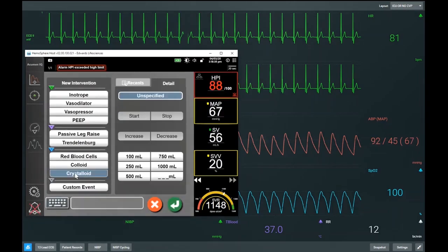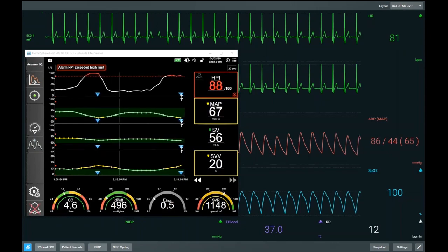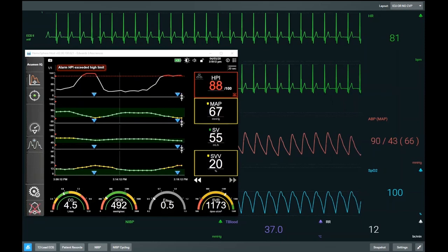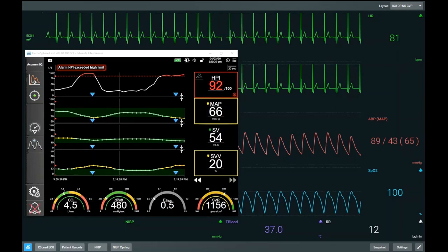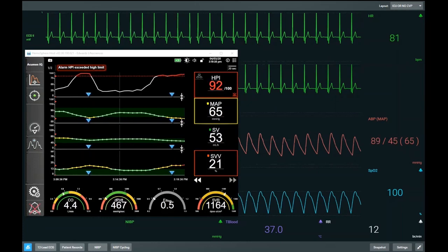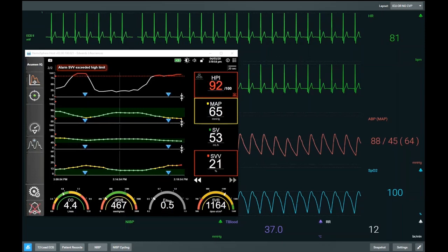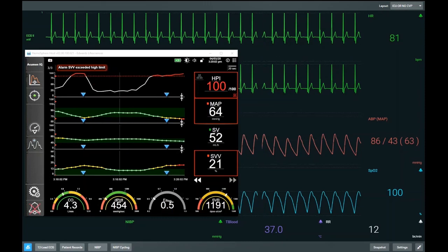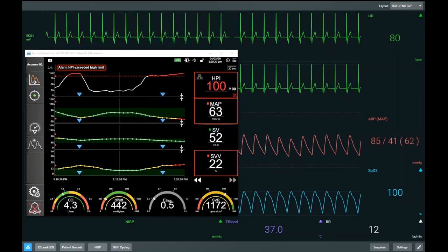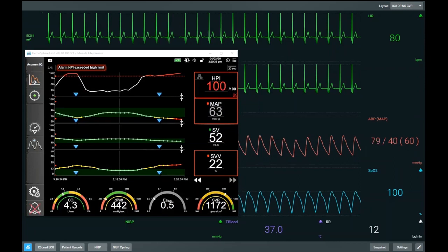When we give this individual a fluid bolus, giving that fluid will increase stroke volume because the patient is preload responsive with raised SVV. But because Eadyne is less than 1 — currently 0.5 — that increase in stroke volume will not lead to an increase in blood pressure. This individual will continue to trend towards hypotension. Whilst fluid may have been needed to improve cardiac output or stroke volume, that fluid will not increase mean arterial pressure. We can see we're about to dip into hypotension with MAP dropping below 65 mmHg. By looking at the physiology previously, we knew that a fluid bolus would not improve blood pressure before we ever gave it. Eadyne in this context helps us rationalize whether the intervention we think is correct will have the effect that we want.